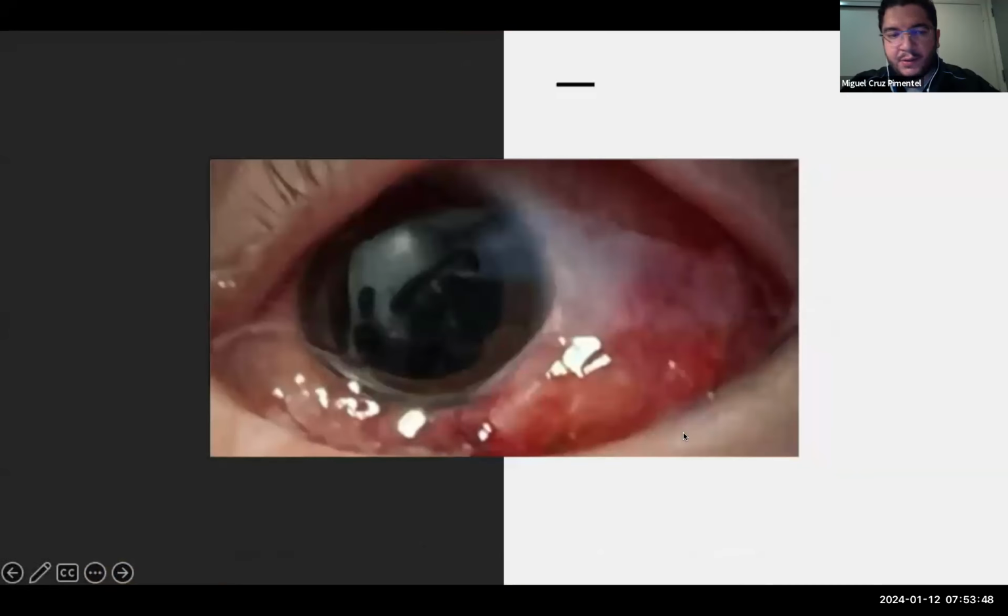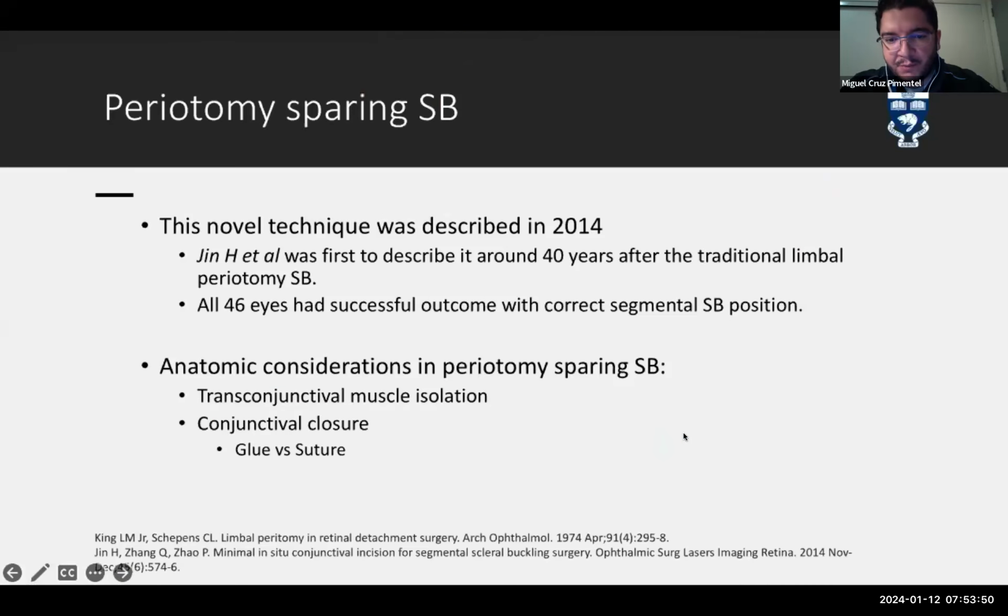I would just like to add a few points while Muhammad is going through his presentation. As Dr. Slomovy pointed out, there is good evidence from strabismus surgeries, proven in a randomized controlled trial, that the use of absorbable sutures can cause more redness and irritation. So fibrin sealant is a good option to decrease the redness and irritation, and that's what we are seeing in this case.